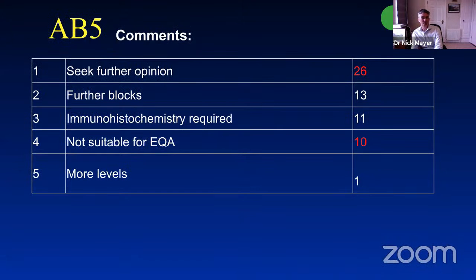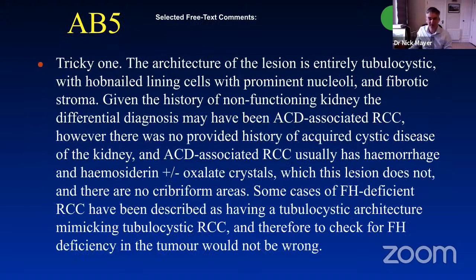So a lot of people, 26 saying this was very difficult, 10 saying not suitable for EQA, and 26 people would have sought even a further opinion. And in fact, a further opinion was sought by the submitting pathologist. So that's giving us an idea of the level of difficulty, which is considerable. And this is a very comprehensive comment here, which takes us through the main differentials and issues of this case. So thank you for whoever took the time to write all this in.